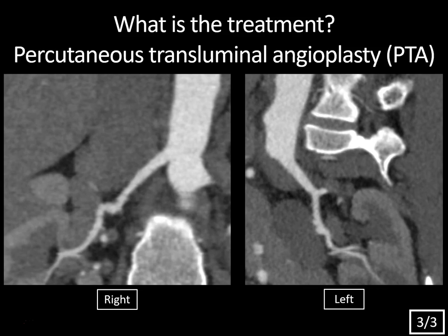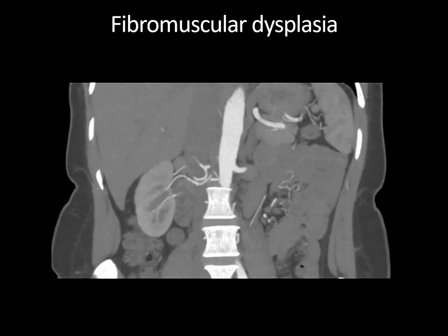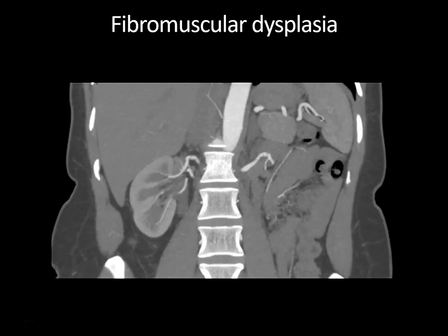Asymptomatic patients are often just followed. This is a case where the curved planar reformats and 3D volume rendered images actually show the disease better than the standard MIPs. On these coronal MIP images, you can see the beaded appearance of the renal arteries bilaterally, but it's much more apparent on the volume rendered and CPR images in this case.